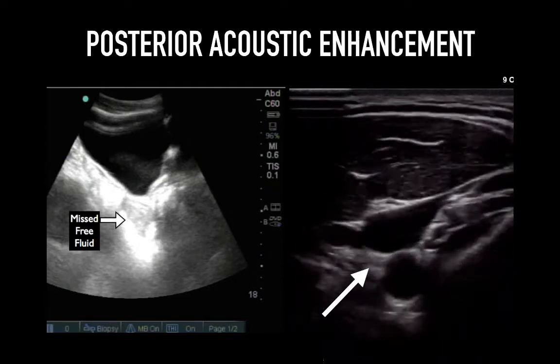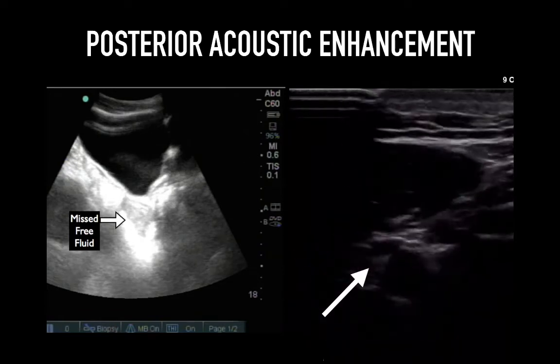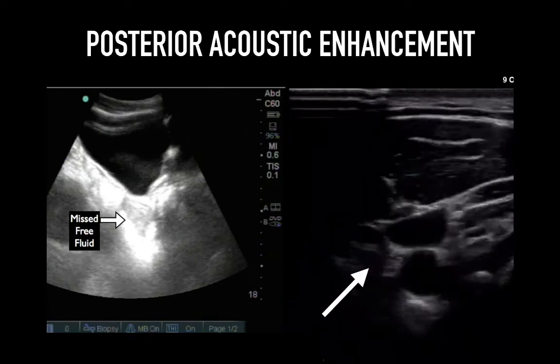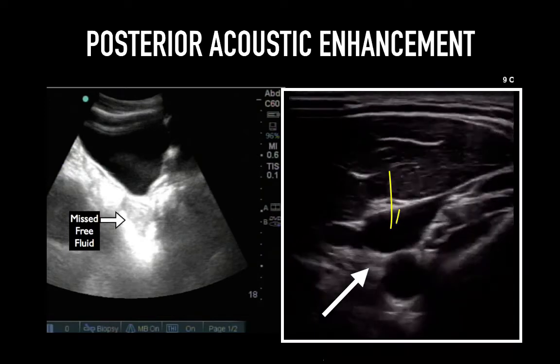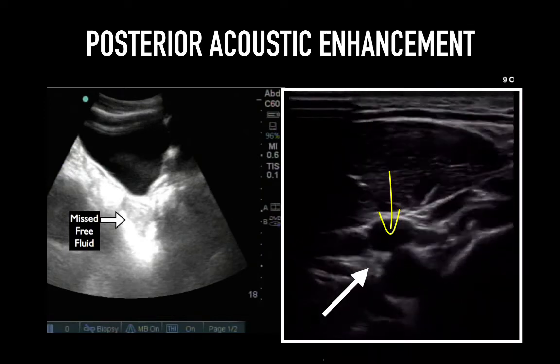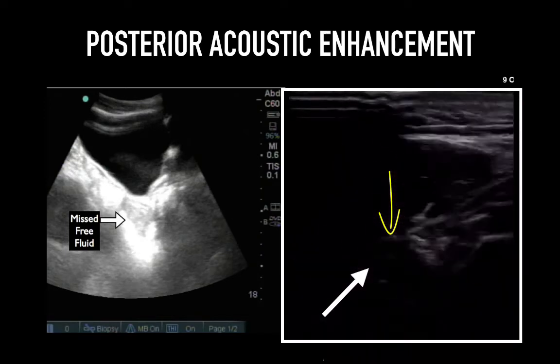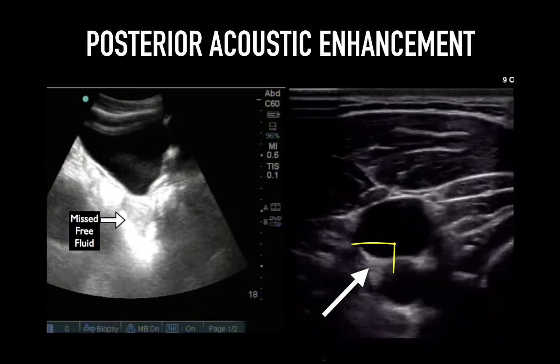This artifact can also hide things, as we see in this longitudinal pelvic view. The image on the right shows the internal jugular vein with increased brightness posterior to it.